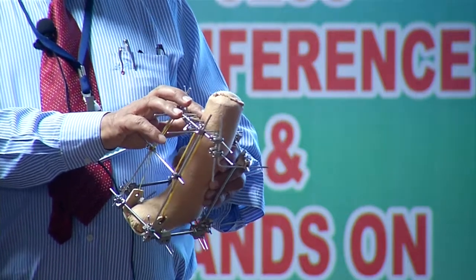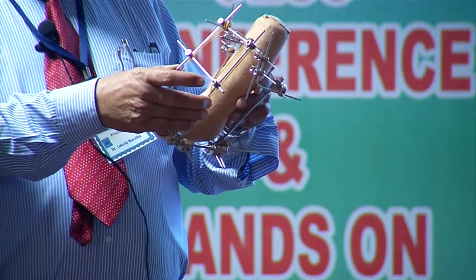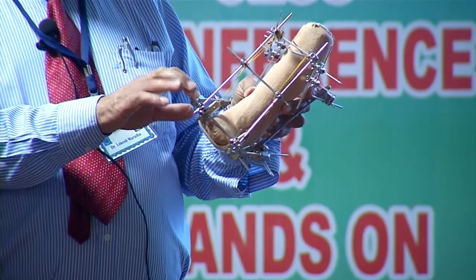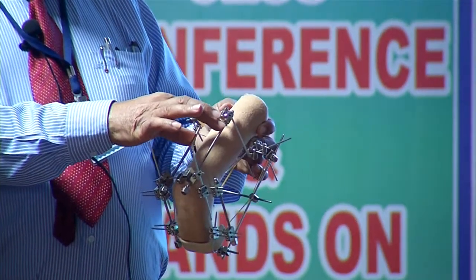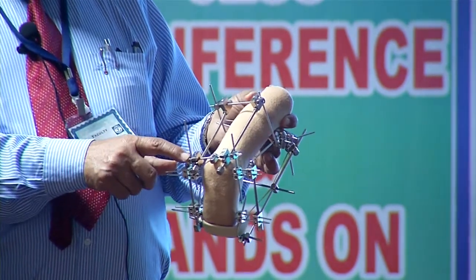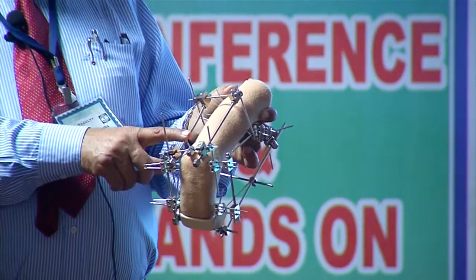Once you have made the constructs on the metatarsal, calcaneum, and proximal part of the tibia, connect these holds with the connecting rod for the anterior tibia-metatarsal connection. Posteriorly, use two distractors to distract posteriorly, connecting the tibia-calcaneal hold. These distractors are open-mouth so you can always readjust them.